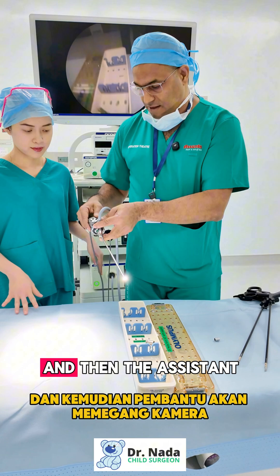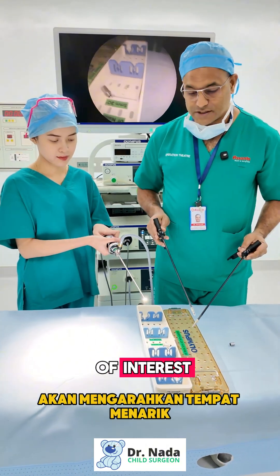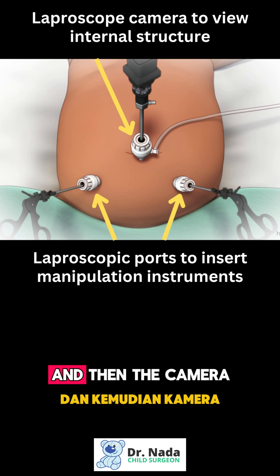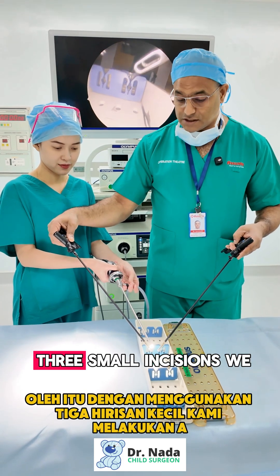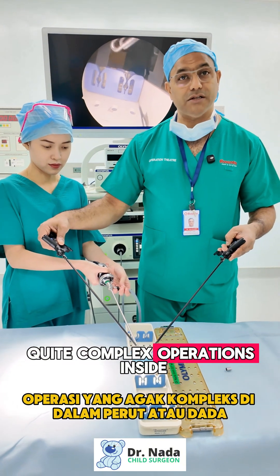The assistant holds the camera and directs it to the point of interest. There will be two other ports introducing instruments here and here, and the camera looks at that area so we can perform the operation inside. By using three small incisions, we do quite complex operations.